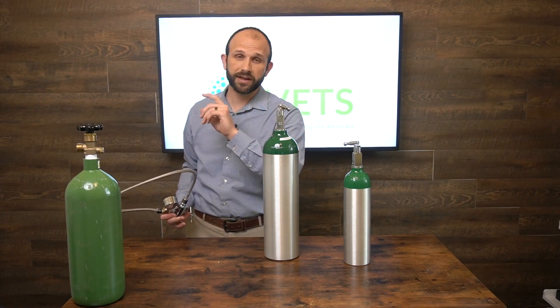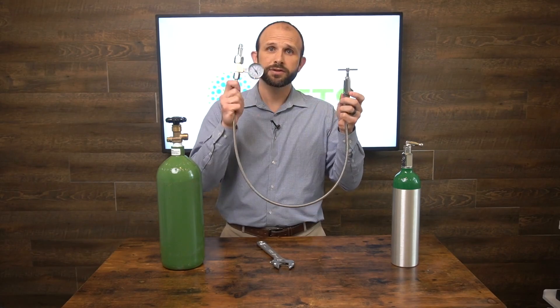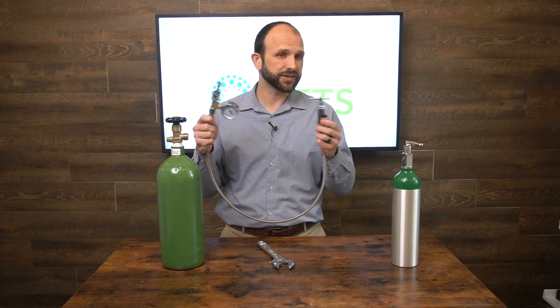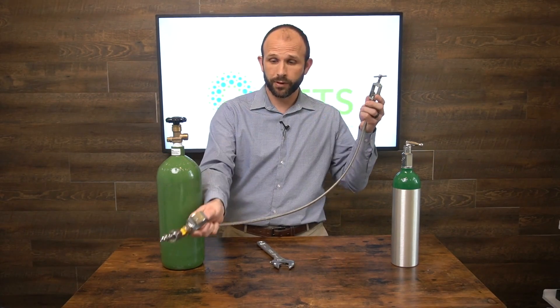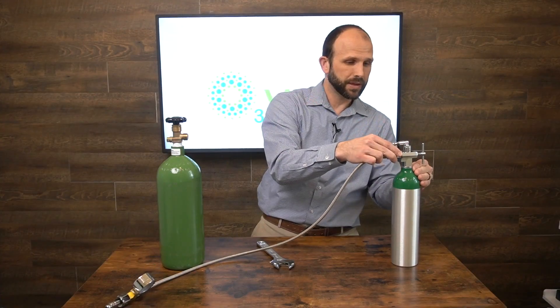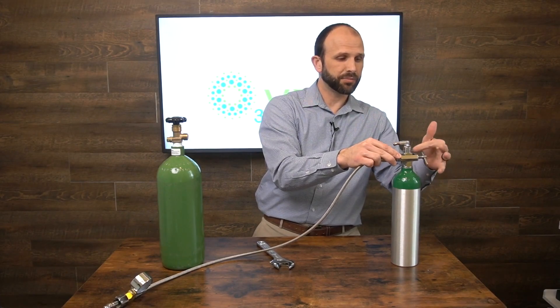I'll show you one other setup: how to fill from a medical tank to an industrial tank. We have a medical-to-industrial transfill hose here — it transfers oxygen from one tank to the other. I'm going to take the medical tank and slide this over the stem, making sure it's lined up properly so it slides right into place.